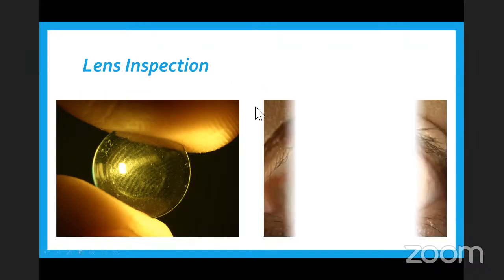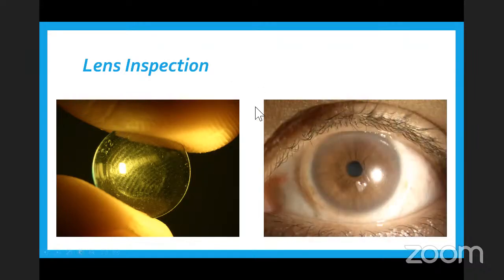This was one patient which we observed during our clinics, and this was a conventional contact lens wearer who has been wearing these lenses for almost 1.5 years plus. And when we looked at the eye, it had a very specific kind of deposit here.